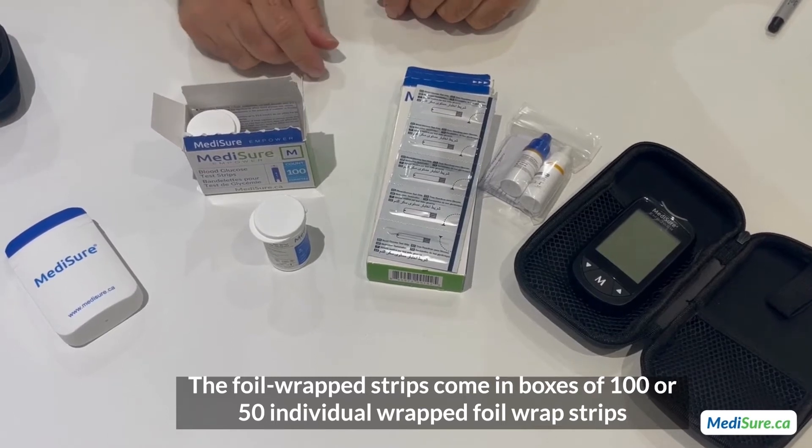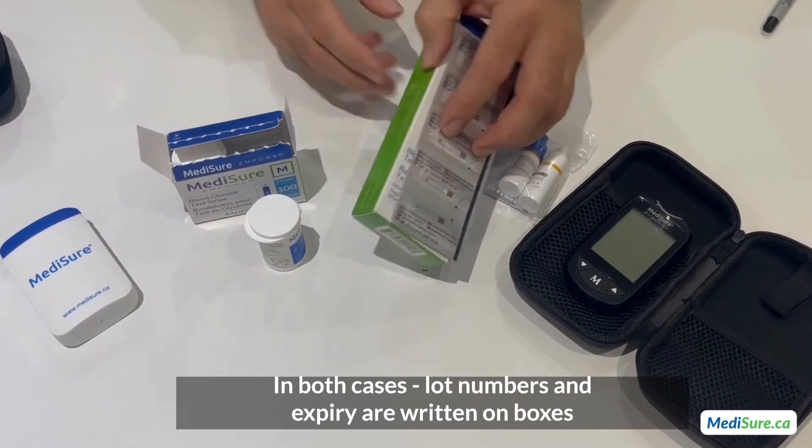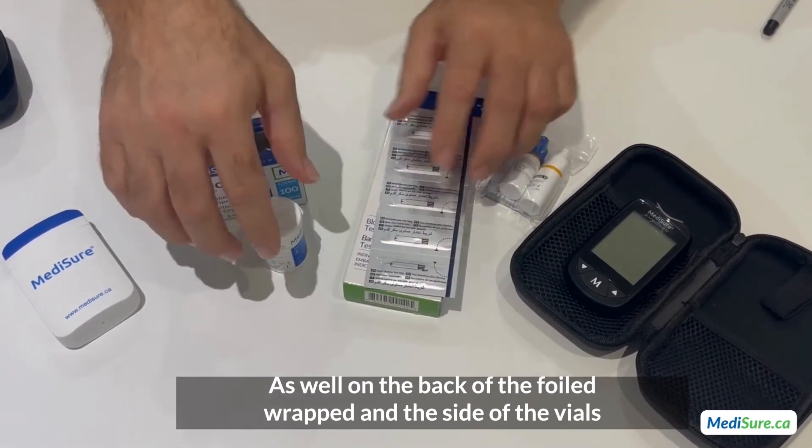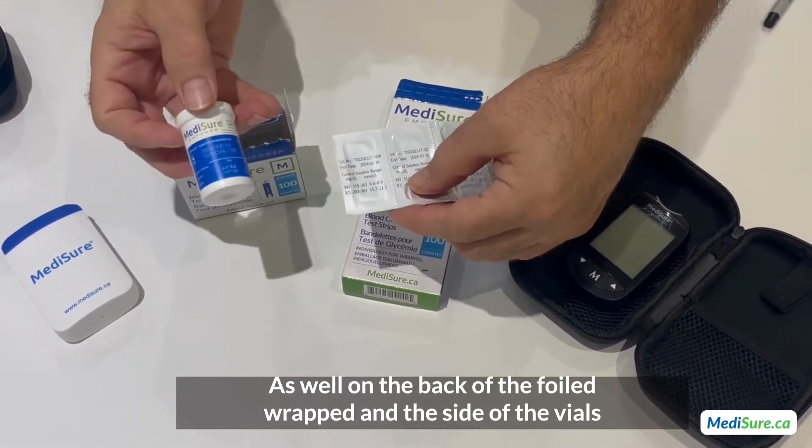In both cases, the lot number and expiry are written on the boxes, as well as on the back of the foil wrap and on the side of the vials.